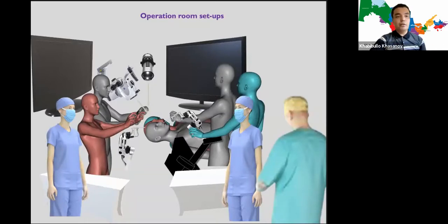So there should be some strict rules that everyone should follow. First, we must always keep each surgical team's instrumentation systems on two separate tables, so they don't interfere with each other. And there is always a main surgeon, who is the most important one, because he is always one of the seniors and experienced doctors. He can provide both the endoscopic transsphenoidal surgery team and the transcranial endoscopic or microscopic transcranial surgery team with precise instructions by observing both displays, and he can guide one team and the second team to achieve a better, safer, and maximal resection of the tumors.